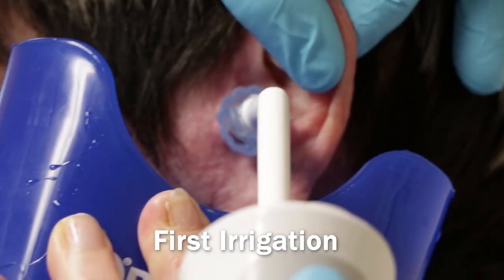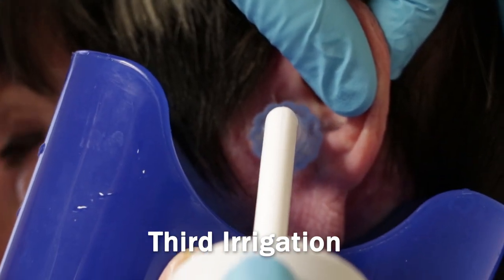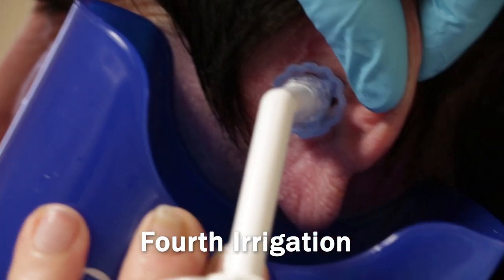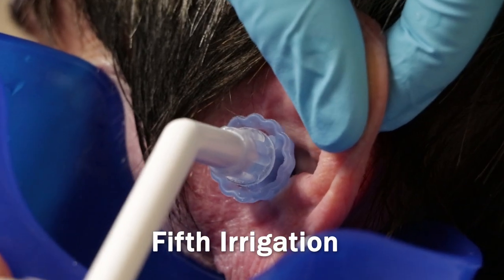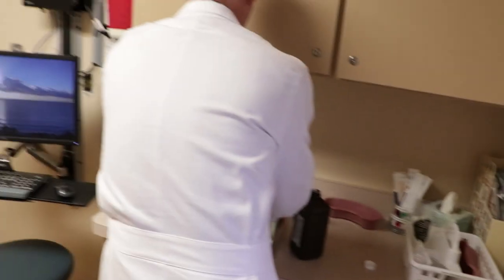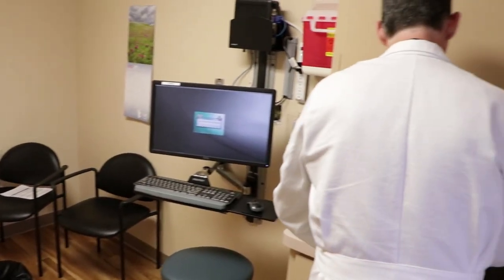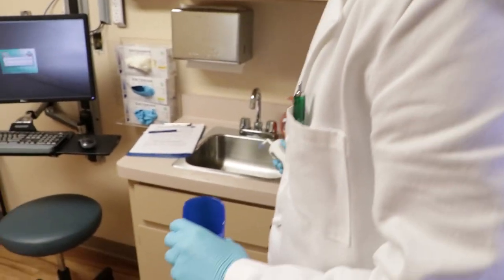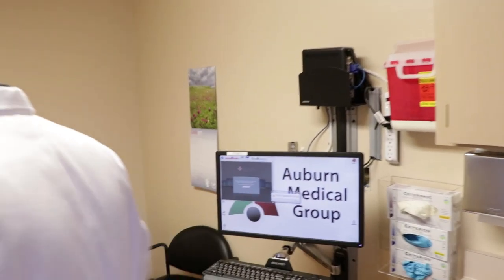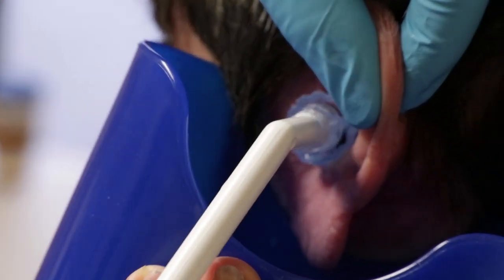Can I help? Here we go. The pressure against the eardrum makes you a little nervous, but I don't think — well, there have been cases of people blowing water through the eardrum, but not with this device. Let me briefly show — it squirts, but it's not direct. It hits the sides of the ear canal, and that's why it's considered safer than just taking a syringe and squirting straight in. Many devices squirt straight in.